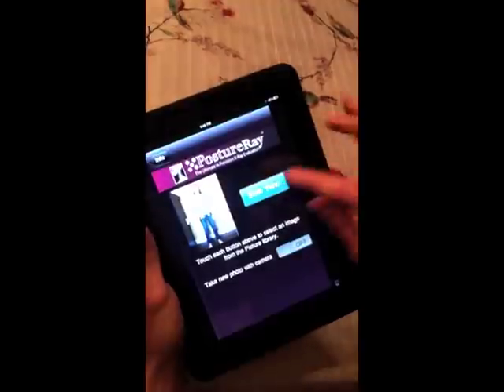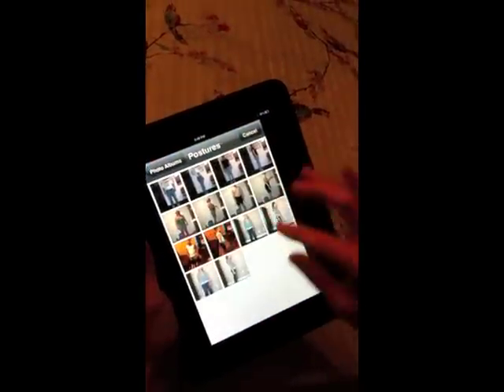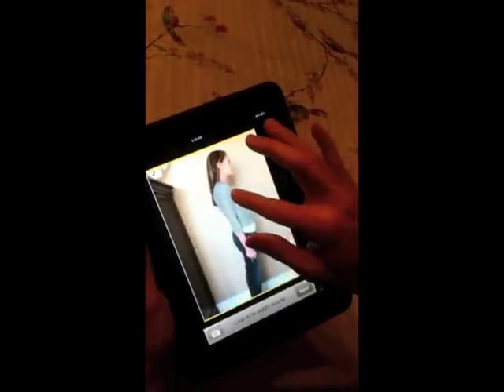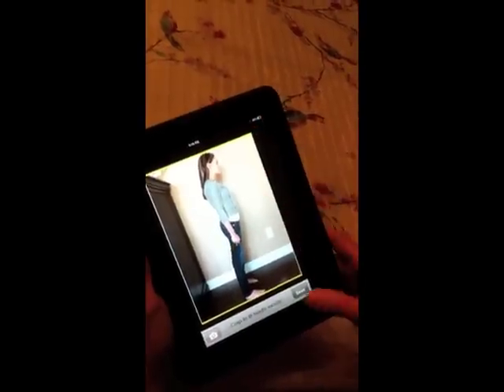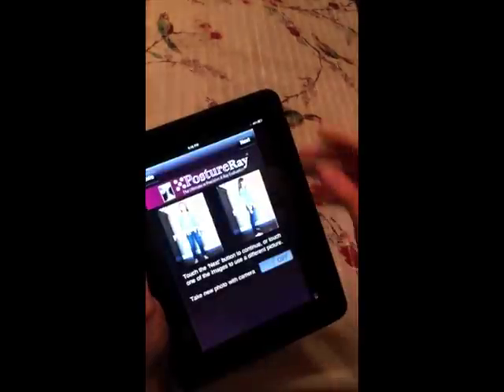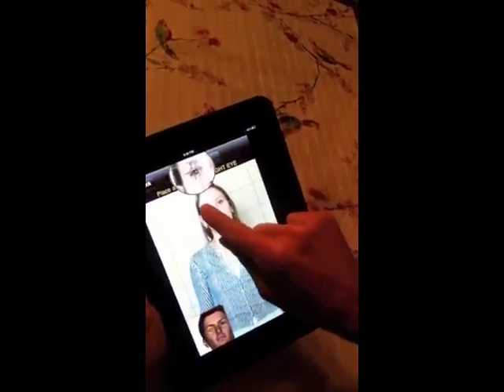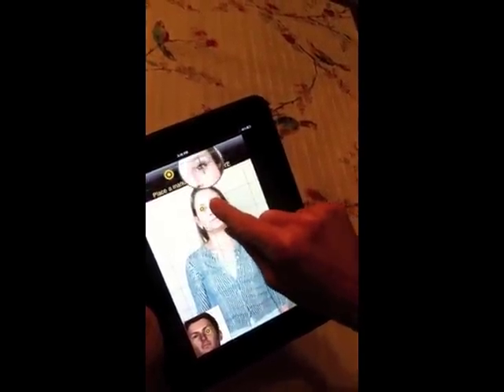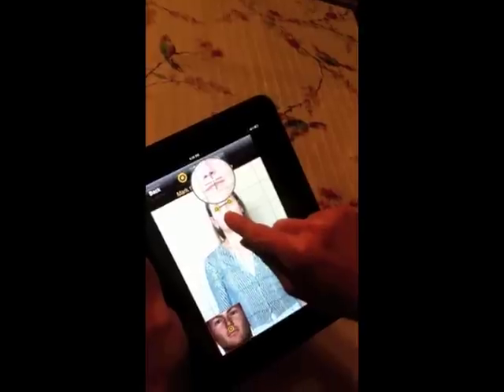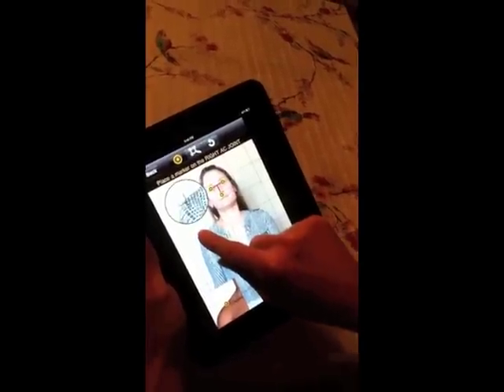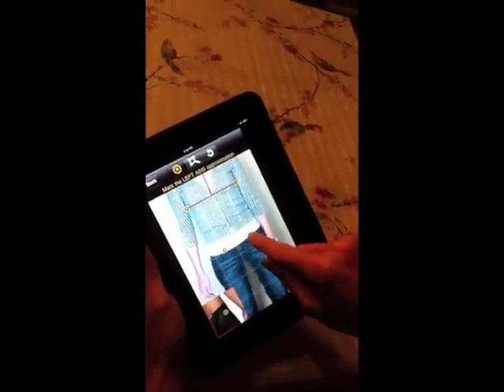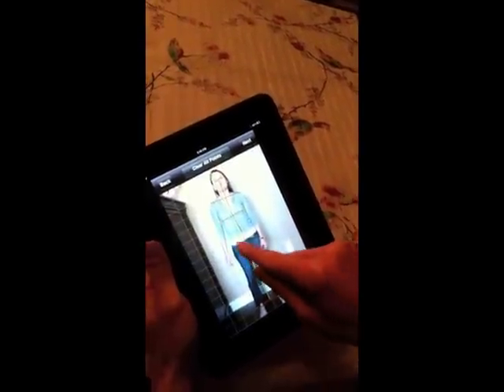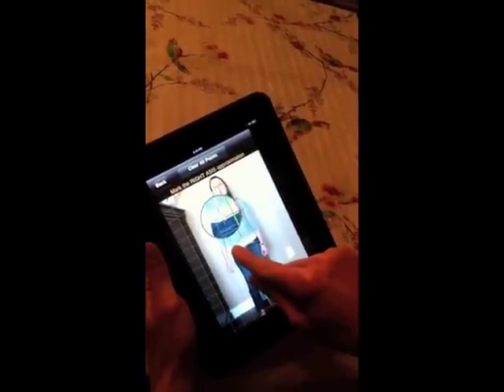We're going to center her, zoom her, and also do the lateral view — we always want to do the right lateral view. Now we're going to digitize the posture. All we do is go over the landmarks just like it shows. If we need to move any points, we can just grab that point and move it over.